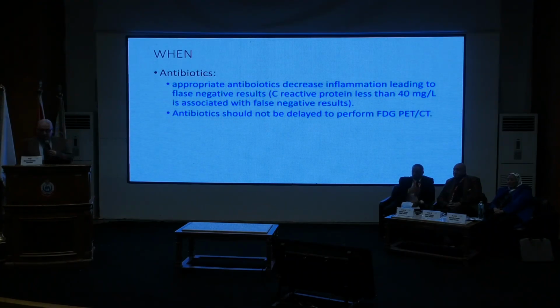Even if the patient is under antibiotics, we know that antibiotic treatment can lead to false negative results because it will reduce inflammation around the prosthesis, but we cannot postpone antibiotics. This is very important.